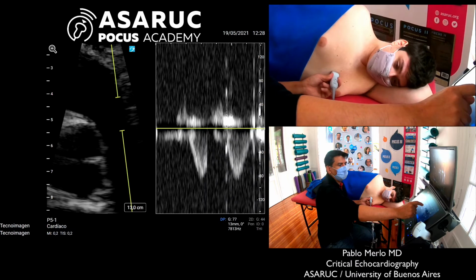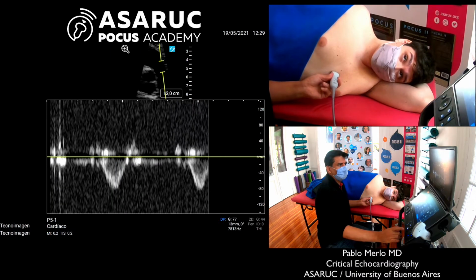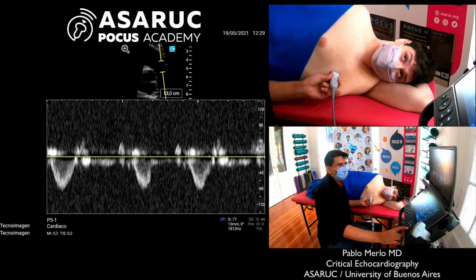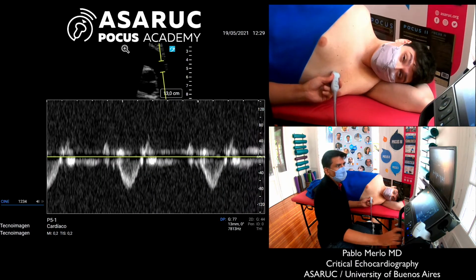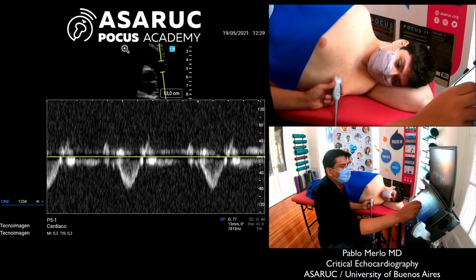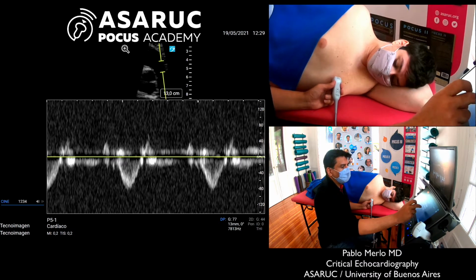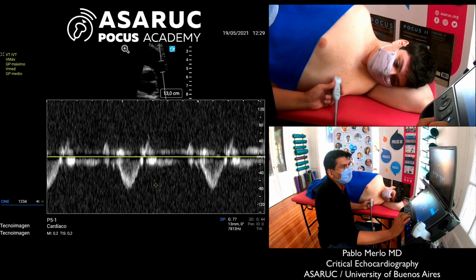Which is normal. There are no cardiac notches, neither end nor mid-systolic. We may also want to obtain the pulmonary valve peak flow velocity, acceleration time, and velocity time integral. This device has measurement tools that enable us to do all that. How do we do it?